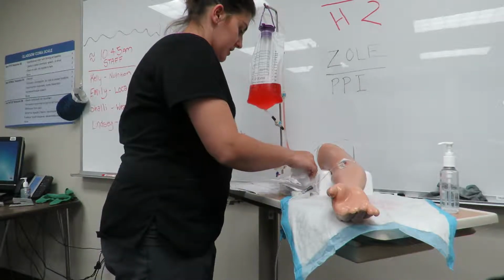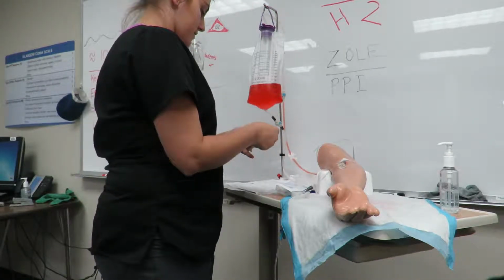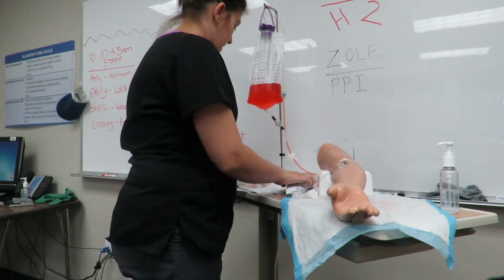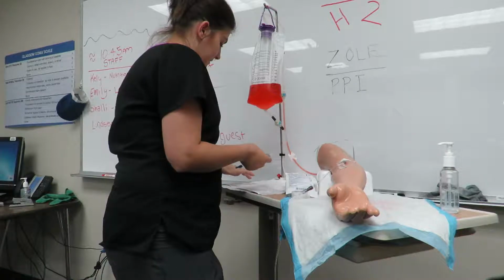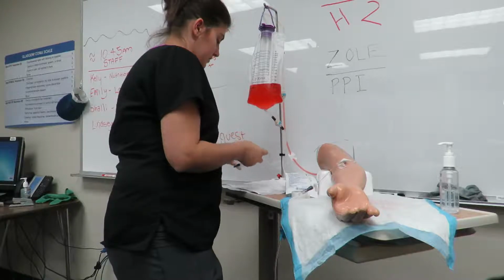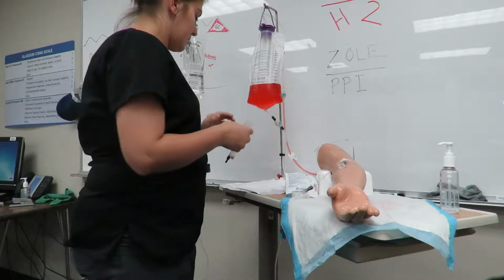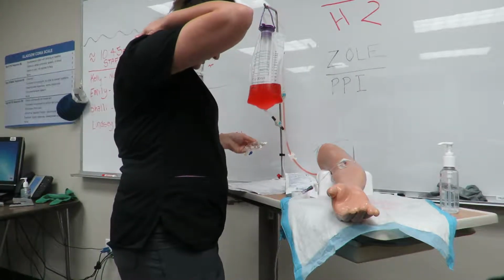Okay, so what I'm going to do is I'm just going to make sure I have everything here. I'm going to check the integrity of my ceftriaxone and check the integrity of my tubing here. Everything looks good. I'm just going to double check this, do my first check with the MAR. It's ceftriaxone, second check, ceftriaxone. And then the 5 rights are right patient, right drug, right dose, right time, and right route. And then I'm going to do another check. Ceftriaxone. So I've done my 3 checks.